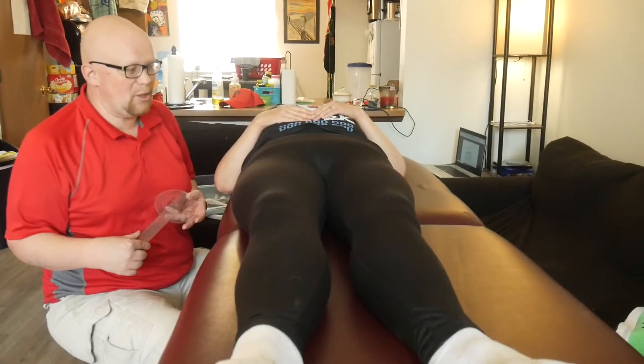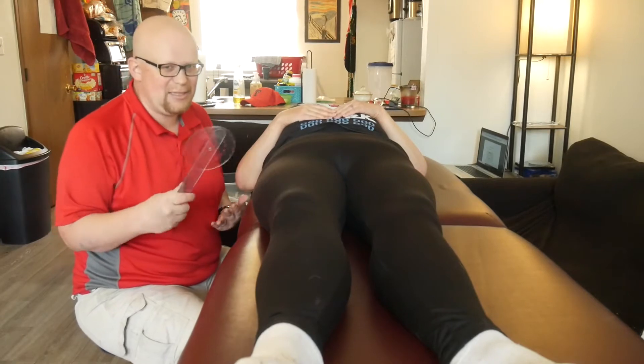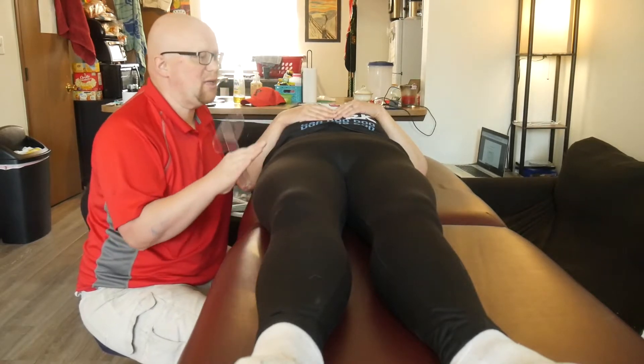Our next hip measurement is going to be hip abduction. We'll do adduction next. For this, you want to have the patient scoot to the other side of the table as far as they can.